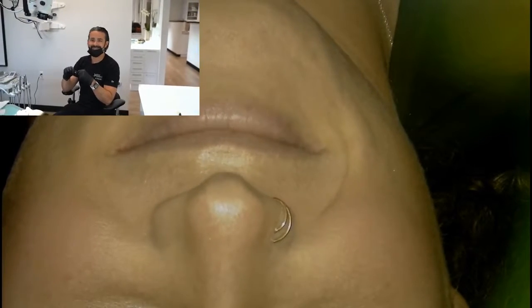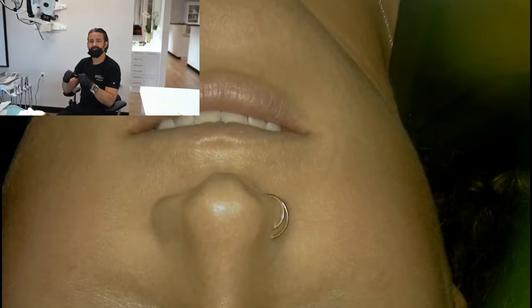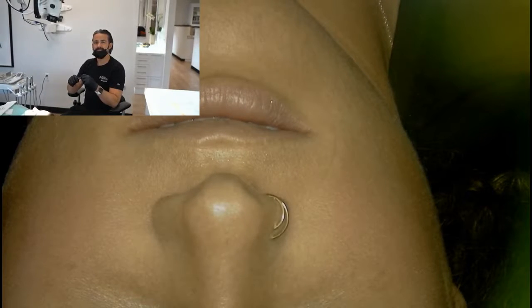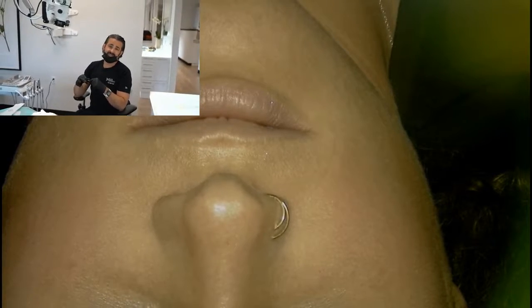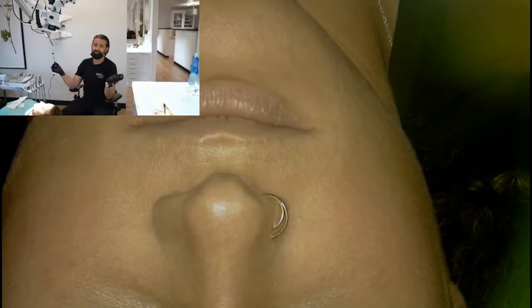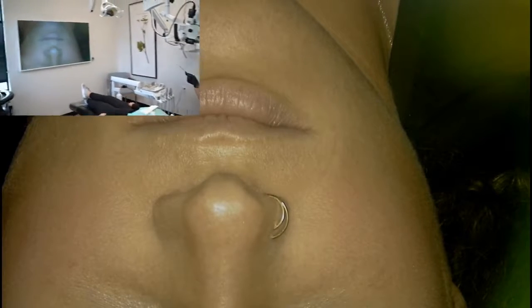He's a stud. He says, how useful is using a big LCD for projecting the image from the microscope? Do you use only the projected image without looking inside the microscope? Thank you. I think in general dentistry, that's not a bad statement. As an endodontist, no. Most people aren't wanting to look at a big TV screen.